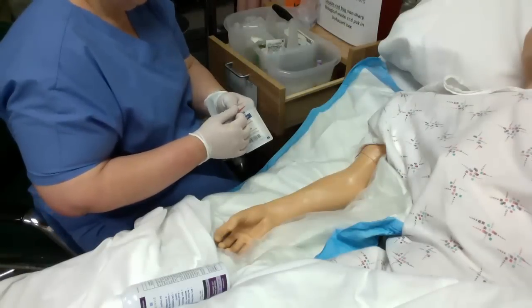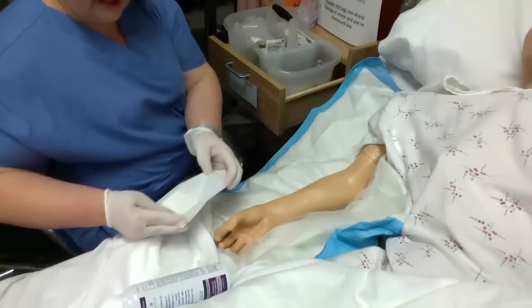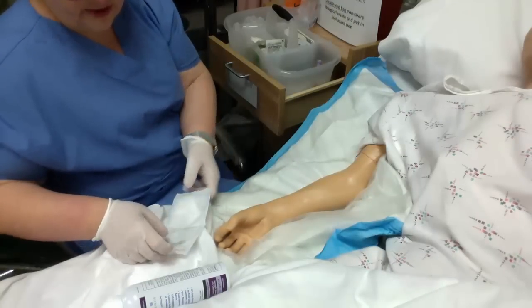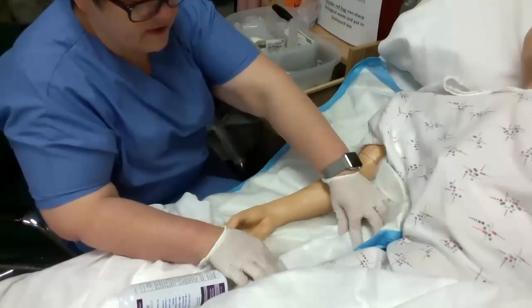Like I said in the podcast, your gauze package has two gauze in it. With the first stick, I didn't separate my gauze out, which I usually do. I separate those out so you can have a clean one after they reach hemostasis. And always make sure you have your supplies right there in reach.